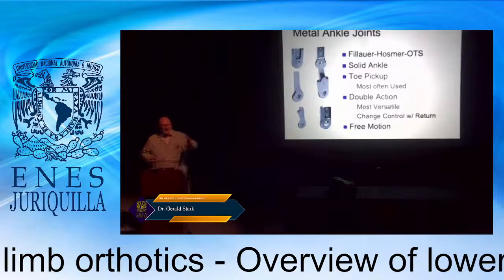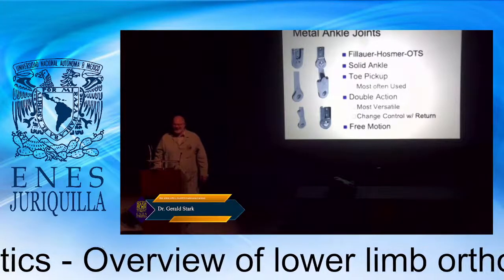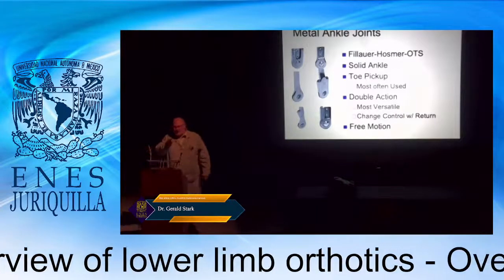Have any of you bent any metal for the uprights for an orthosis? That's always a good experience when you first try to do this because it is quite an art.